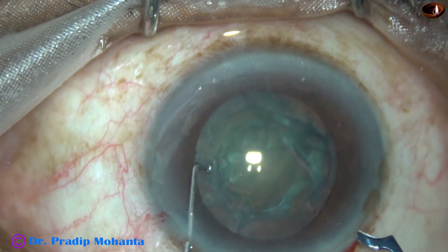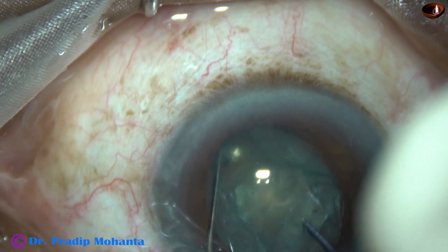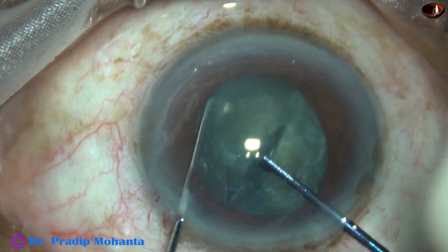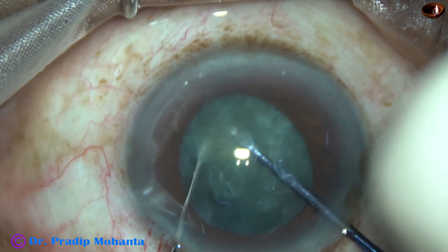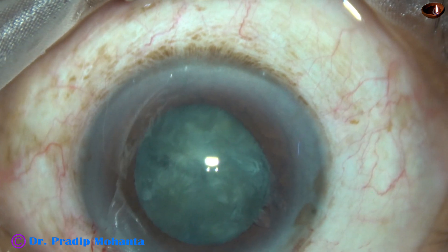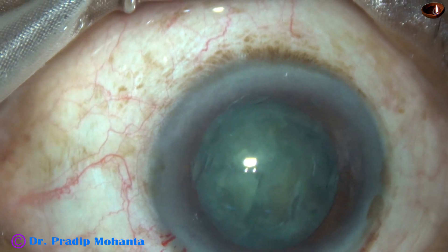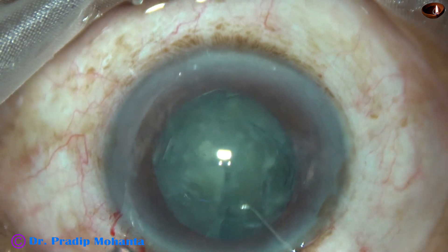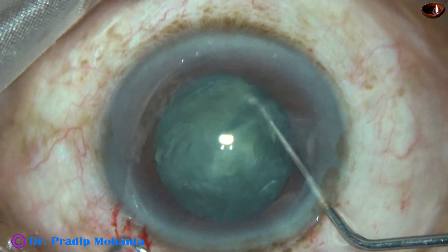I use a pre-chopper to divide this nucleus into four pieces. This is the first pre-chop, dividing the nucleus into two hemi-nuclei, and this hemi-nucleus is chopped into two pieces. Now the anterior chamber has become shallow, so I came out, inject visco, and use a Sinskey hook to rotate the nuclear mass to place the hemi-nucleus, which is to be divided into two pieces, inferiorly.